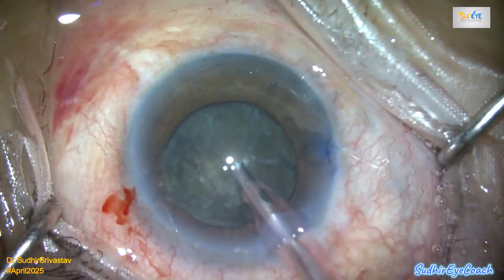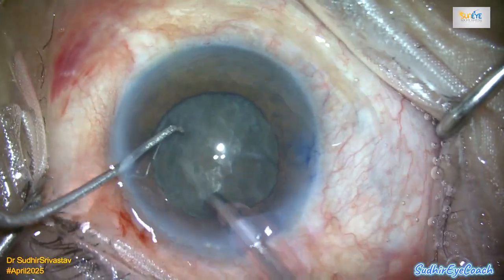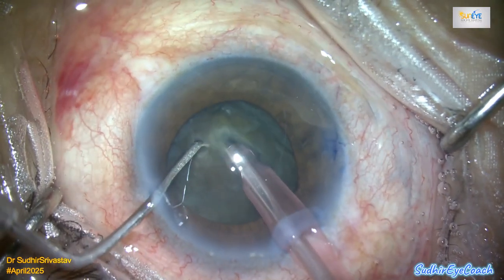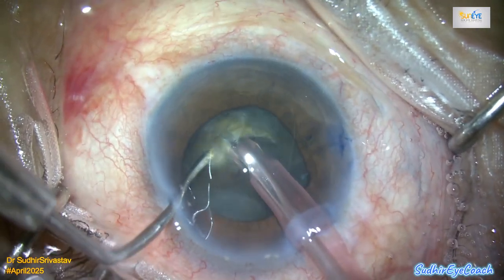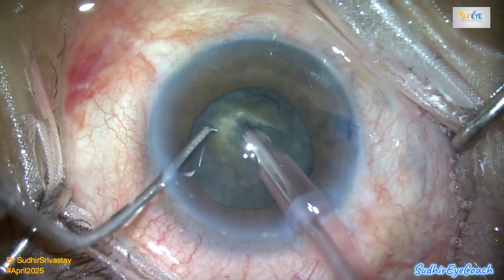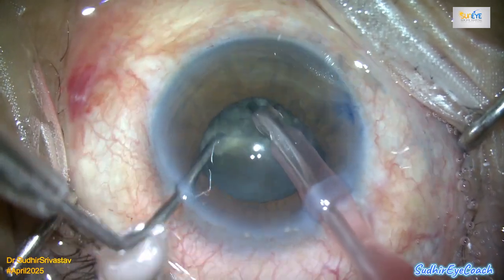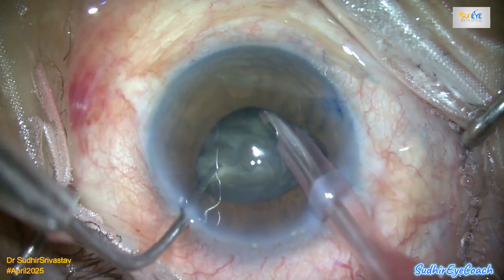Inserting a pupil expander or any kind of iris hooks during phaco can be tricky. So if you stay calm and composed, you can still complete the surgery safely. And here are some key surgical tips for managing small pupils in hard cataracts.